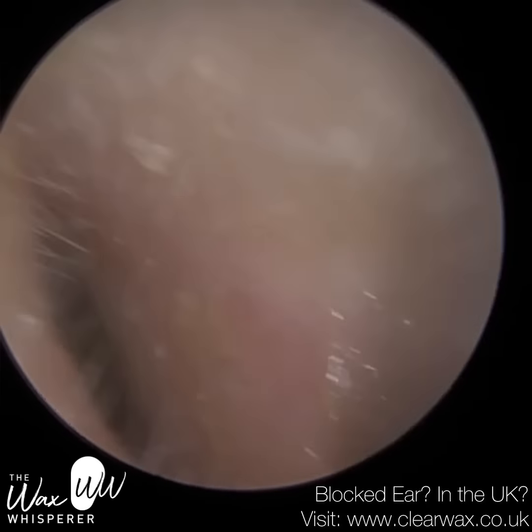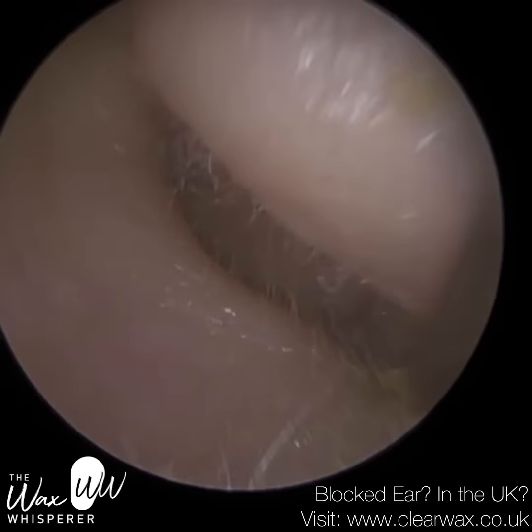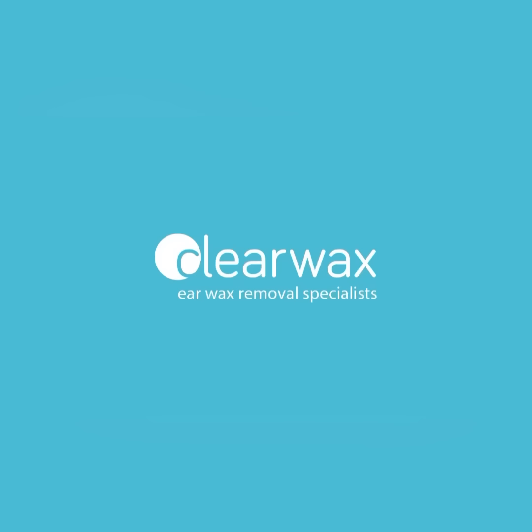So we're just mopping up the entrance here. You're going to see the plug of keratin that I removed from this side as a still image. And this is probably a class 2, so it's sausage-like, but it's lumpy and it's got a high keratin input. So there's a lot more keratin in there, probably like 70% in comparison to lipids.